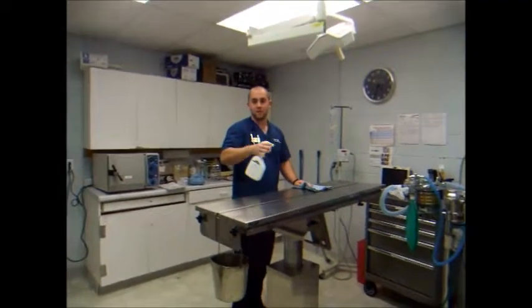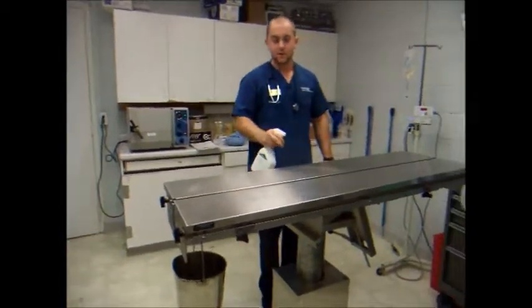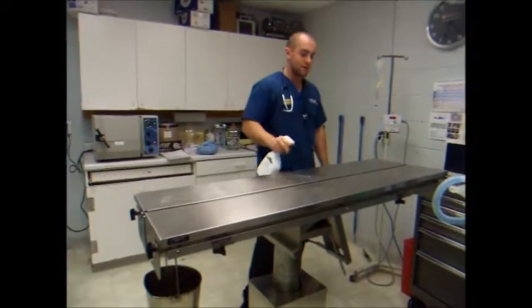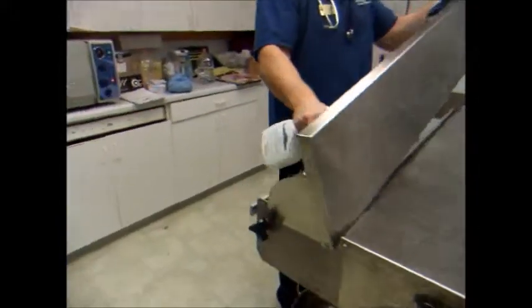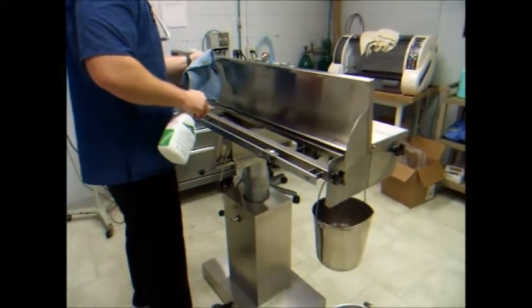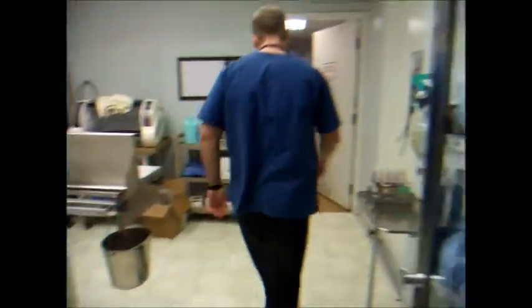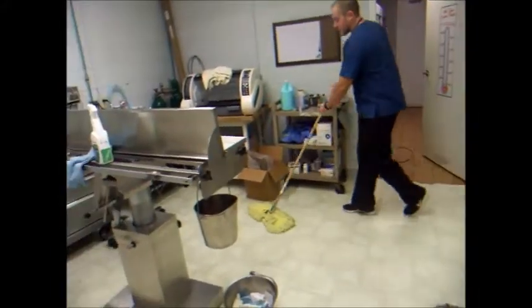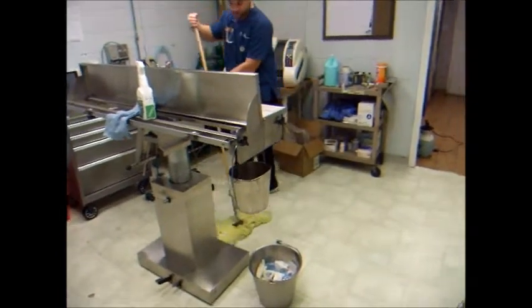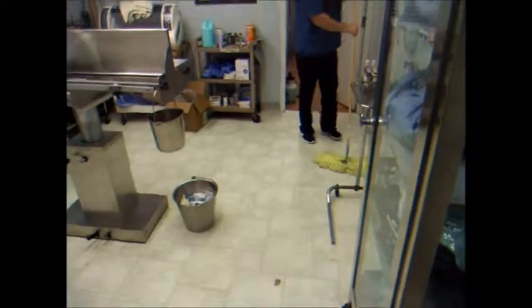Properly show you how to clean the surgical area / room. So I'm going to go ahead and spray down our surgical table with our disinfectant and spray underneath. And we're going to let that sit for a little bit while we sweep the floor. Then after we sweep the floor, spray the floor with our disinfectant, and we'll let that sit for just a good 5-10 minutes, and then we will mop.